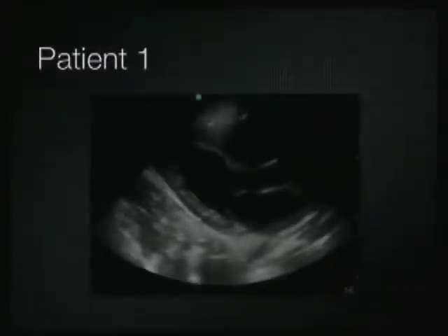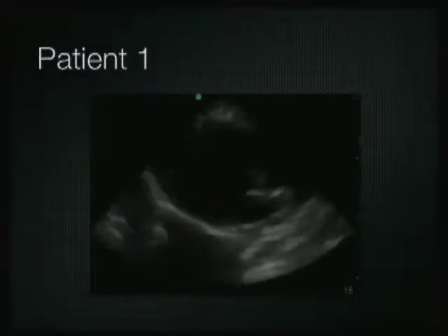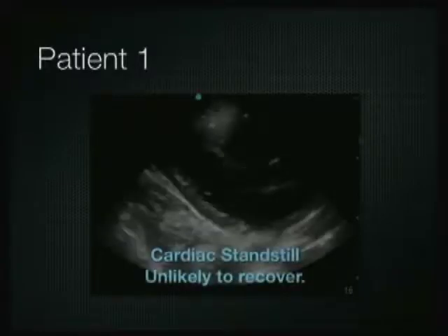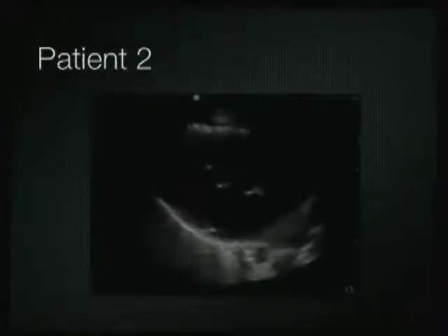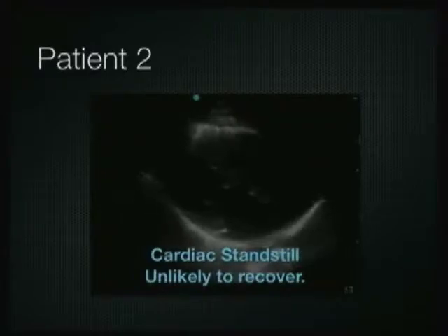So let's get our ultrasound for these 3 patients. In patient number 1, we take a look and we see pretty much no squeezing of the left ventricle in this example. So it's cardiac standstill and our patient's unlikely to recover. In our second patient, again, we see cardiac standstill. The patient is probably not going to recover here.